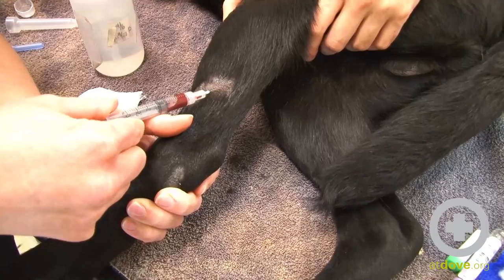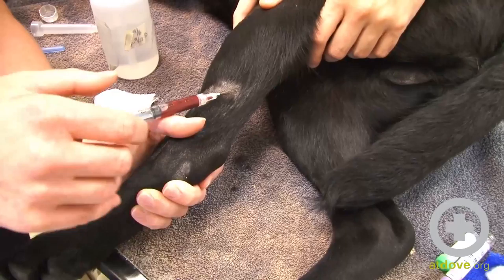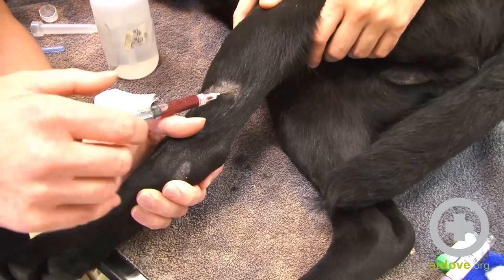Sometimes if I move my thumb underneath, you just want to draw back slowly. I need about two mils for my sample here. So once I get that, place a band-aid over. Sarah can finish that for me. And now I've got my sample. And that's it.